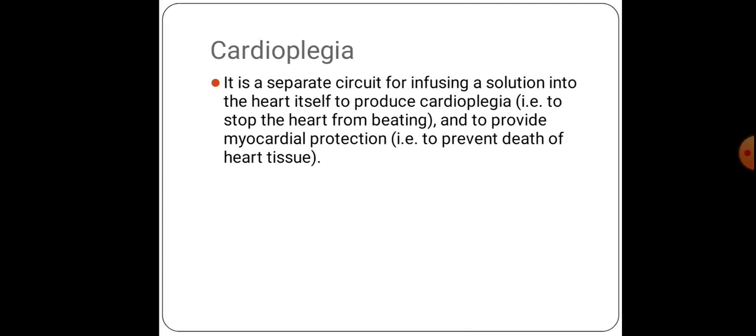Myocardial means muscles, which is nothing but the cardiac muscles. Cardiac muscle protection means preventing the death of the tissues, because we are not providing blood. So we have to prevent myocardial infarction with the help of the cardioplegia unit.